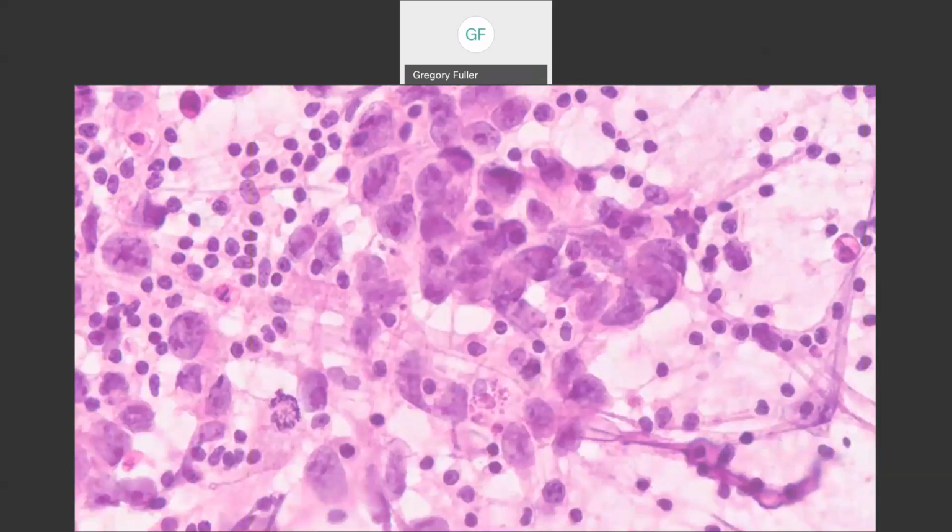Here's another example. One other additional feature. I'll give you a second. What is the new additional cytologic histologic feature that just showed up that we did not see in the first two histologic panels? Does anyone see it? What is it? Look around. I'm going to give you another couple of seconds here. All right. Yes, mitosis. Esther Ivan. Yes, mitosis. That's it.